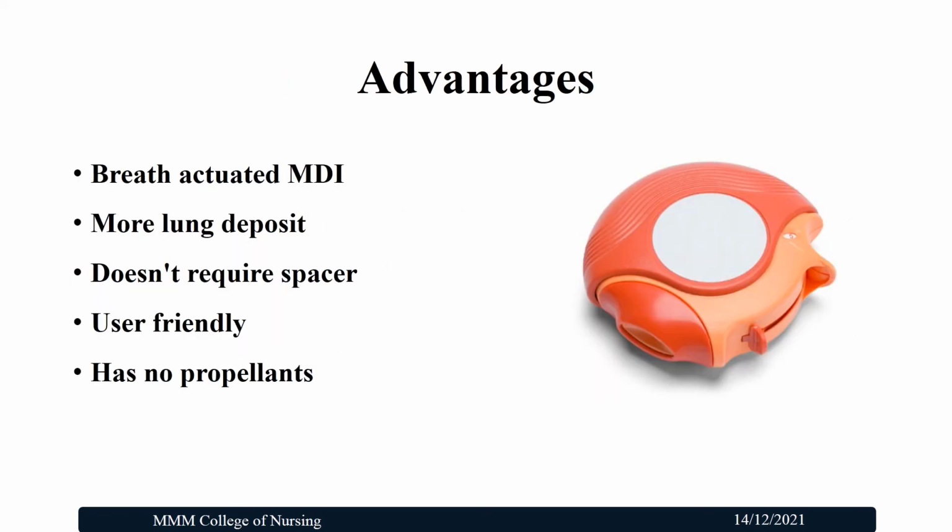It is a type of breath activated inhaler, and in this method more lung deposition of medicine is possible. It doesn't require any spacer, as it does not need much technique and coordination. It is so user friendly and it doesn't have any propellants.